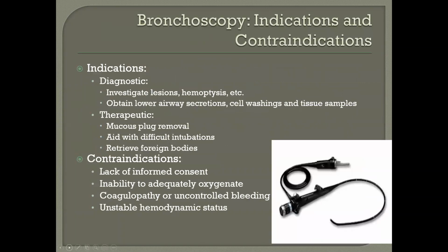Indications, contraindications. Indications, diagnostic: to investigate lesions, hemoptysis, etc. Obtain lower airway secretions, cell washings, and tissue samples. Therapeutic: mucus plug removal, aid with difficult intubations, retrieve foreign bodies. I could talk a lot about them, but we retrieve different things out of patients.